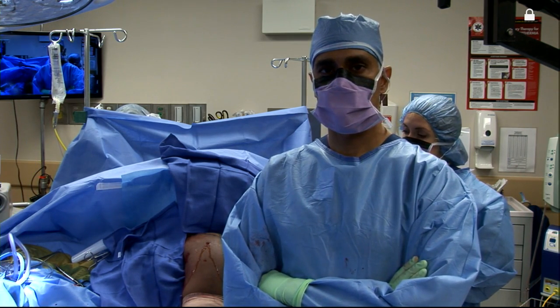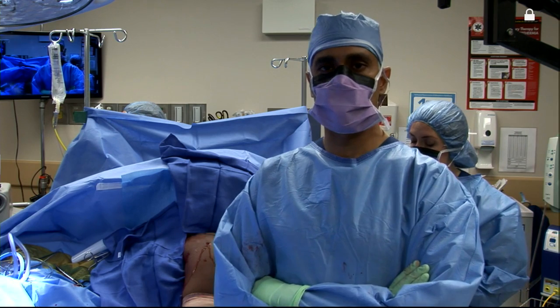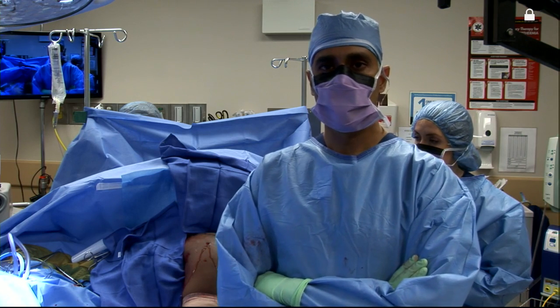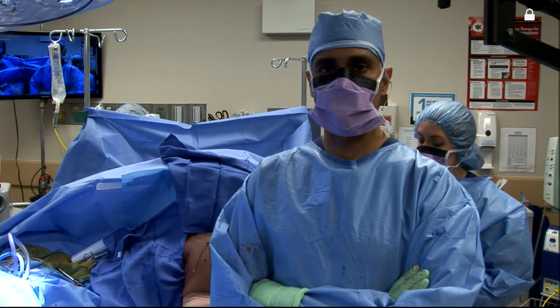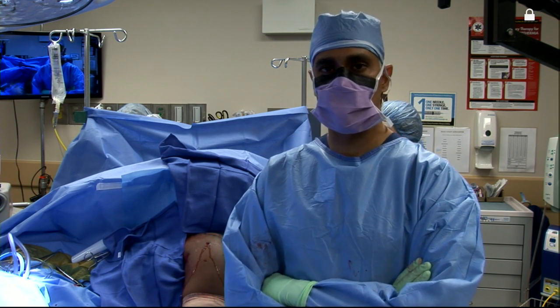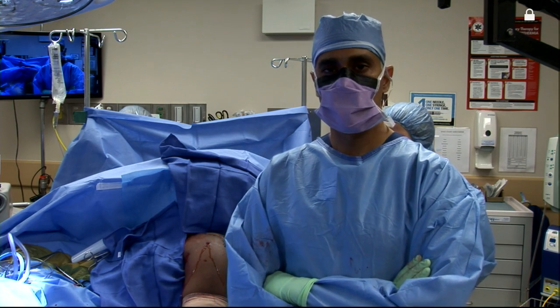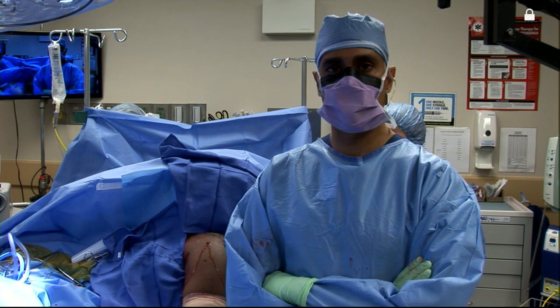You did your biceps tenodesis through an incision. Do you ever do these all arthroscopically or is there an indication for that? I don't know that there's a difference in the indications. When I do them arthroscopically, I'll do a suprapec location — below the groove but above the pectoralis major using a screw fixation. I think in my hands, the indication may be the younger patient who's looking for a cosmetic approach. Having said that, my experience has been that you can make this a very cosmetic incision hidden within the axilla. My feeling is that my ability to eliminate any diseased portion of the tendon and eliminate the biceps as a cause of post-operative anterior shoulder pain has led me to do a subpectoral tenodesis in the vast majority of cases. I do less than 10 arthroscopic per year, and it's primarily if it's a patient request.